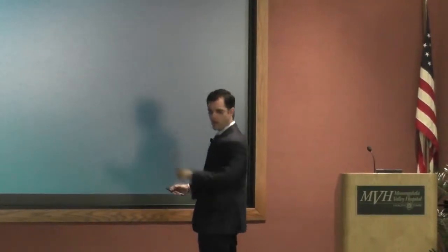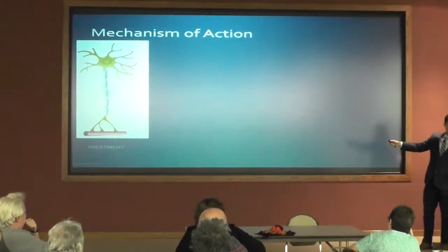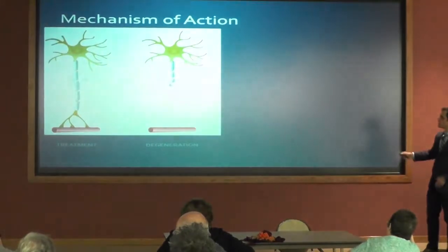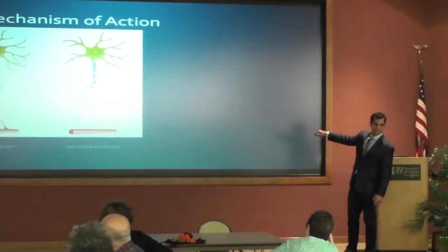All right, more on how it works. This is a nerve. These little fingers that are coming out are reaching out and getting sensation. So it can get temperature sensation, pain signals. Those signals travel down the nerve, go all the way down to here, and touch this thing that's shown here in red. This is representing the central nervous system, or the spinal cord, and eventually the brain. You apply cold to this area, and you get basically disruption of that signaling.